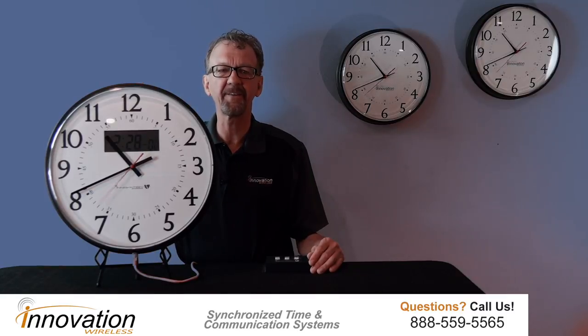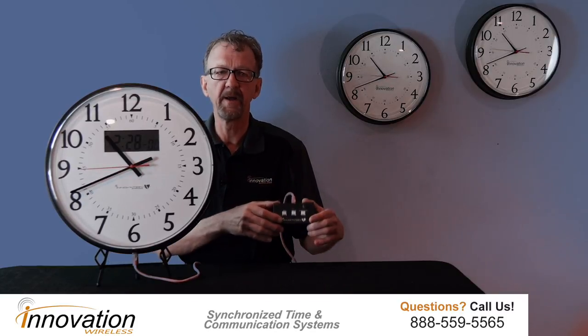Our analog LCD countdown timer has an easy-to-view LCD digital panel on the dial face that is controlled by a switch panel. The analog dial face can be either in a 12-hour format or a 24-hour format. The 24-hour format is ideal for hospital environments.